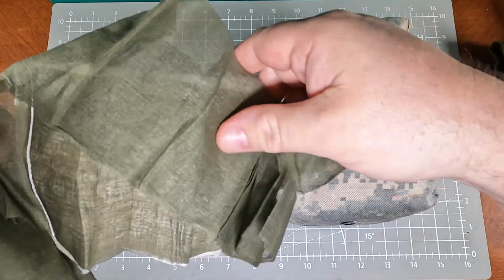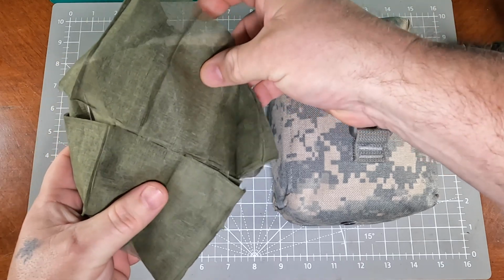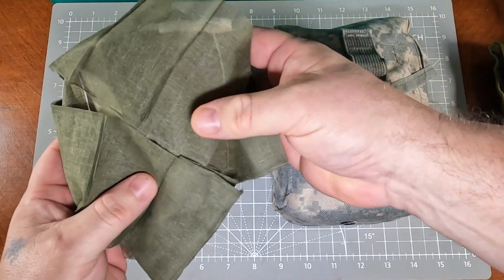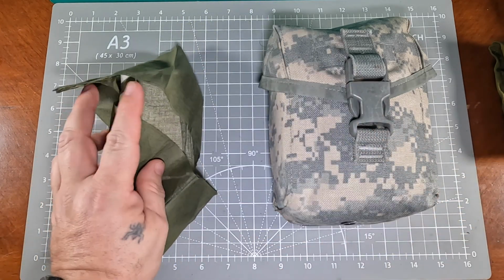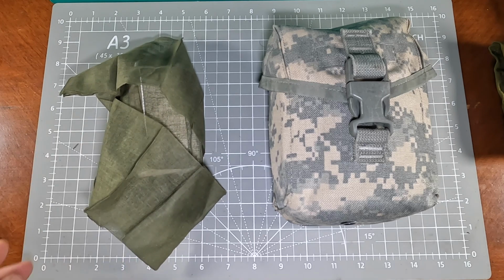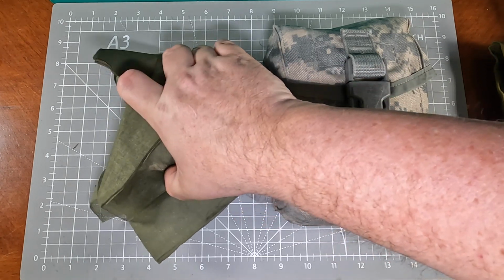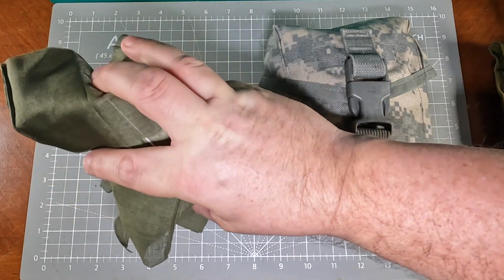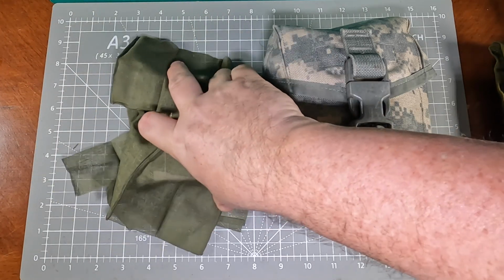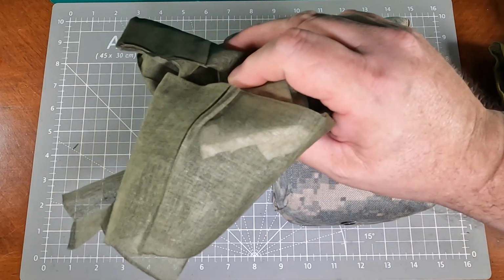They'd always tell you in the military, make sure that the white ends on the edges were completely wrapped. So you didn't want to have any white showing, part of the military standards that they did for people and everything. But like I said, these were used forever. When I first came in 1990, they used them. Vietnam, they used them. And even up until right before Operation Iraqi Freedom and Operation Enduring Freedom, these were pretty much what every soldier had. They'd have one on the upper left of their LCE that they'd wear on their suspenders, and all the soldiers had them.